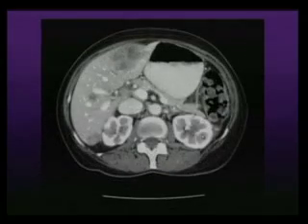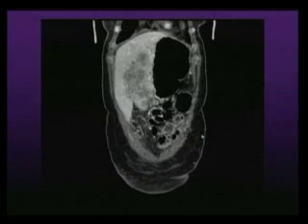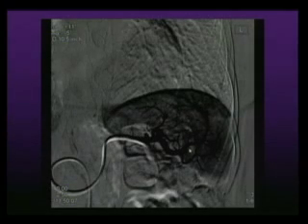That one had a large spleen. So in these cases also, this is the met. See the large met? See the spleen is normal size, so be careful. When the spleen is large, 40% volume can become a big volume. When the spleen is small, that 40% volume can be a small volume. So be careful when you embolize. It's not only dependent on the percentage you embolize, it also depends on the size of the spleen. So I believe what actually makes a difference is the volume embolized.